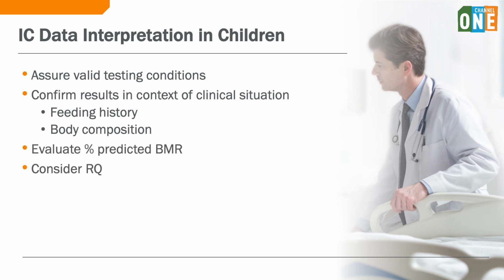And finally, consider the meaning of the RQ and how it may confirm or refute your expectations related to feeding and energy expenditure. I would encourage you to watch other videos in the Indirect Calorimetry Channel 1 series to learn more from my esteemed colleagues on this topic.